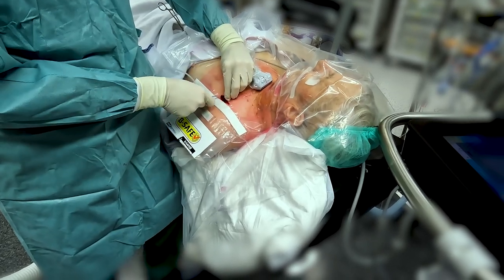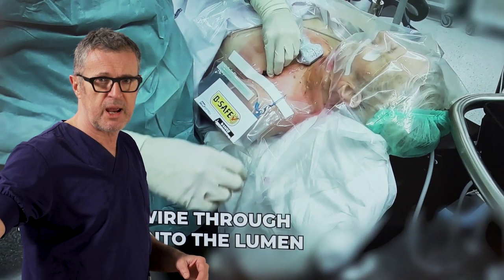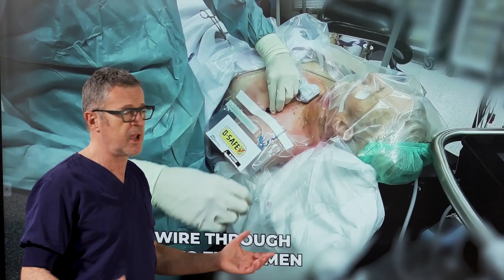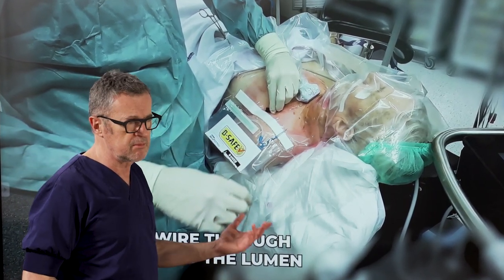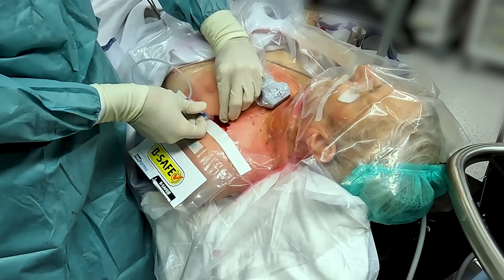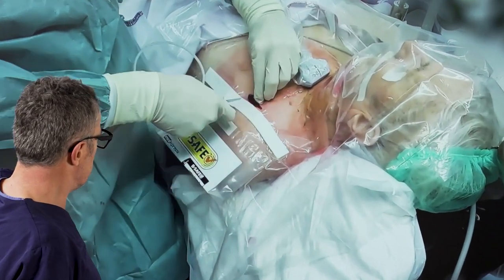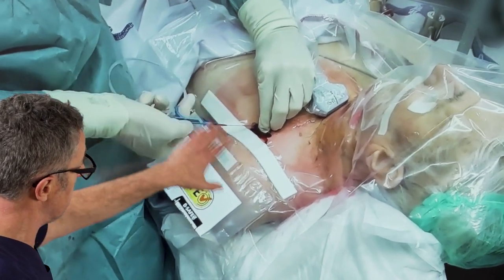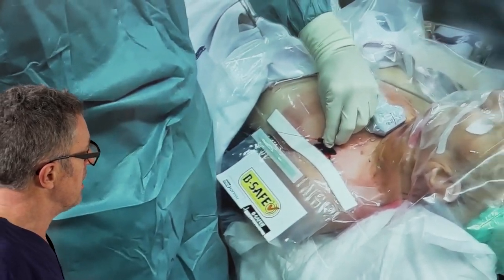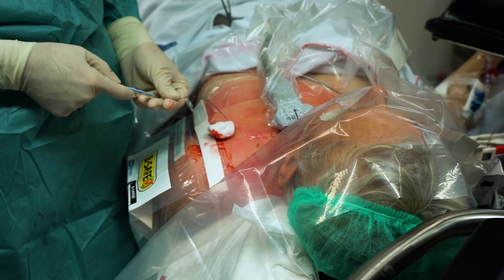Once you get blood flow in that needle you really want to keep it immobile. Reaching far to the tray to get the guide wire can often result in dislodgement of the needle, and then you have to start all over again. Having the guide wire in the equipment pocket of the easy cover universal drape really makes a big difference. Here you can see the adhesive strip will absorb any blood coming out to keep it neat. We place the guide wire through the needle and then take the needle out, so the guide wire is now left inside the subclavian vein.